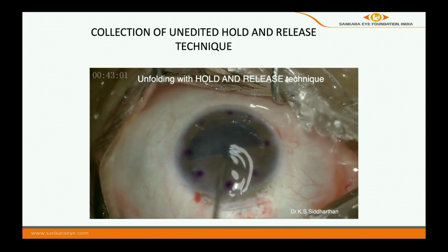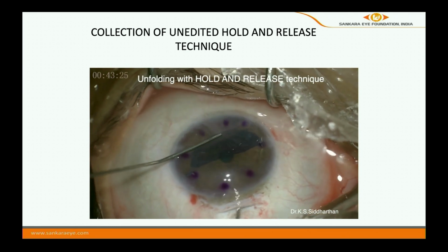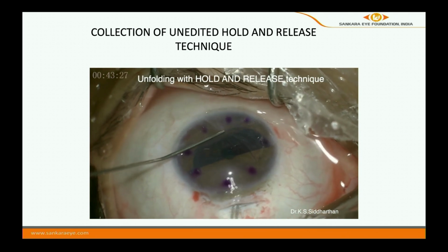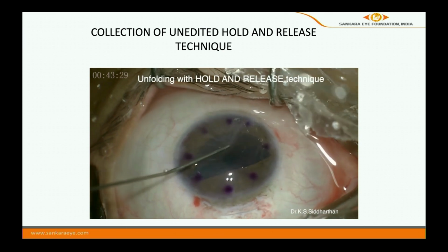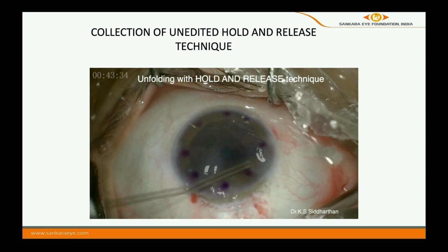So this is actually an anterior iris claw I removed, in an aphakic eye. So I did a scleral tunnel. So here also, see, I'm positioning it, and it just opens. And this was actually a 40-year-old tissue. Because it shallows, it usually comes out.